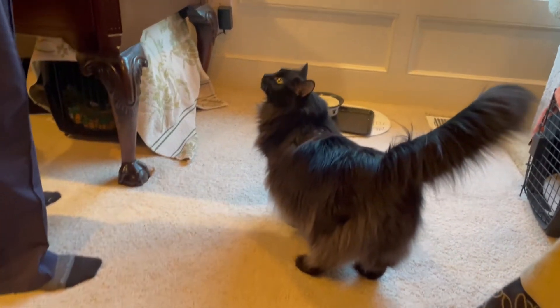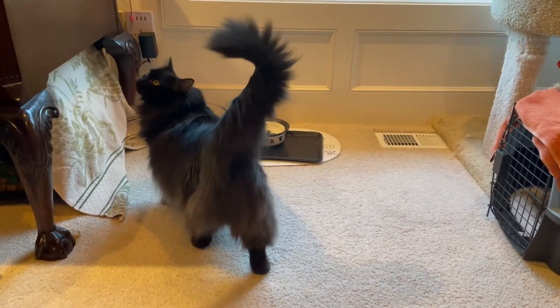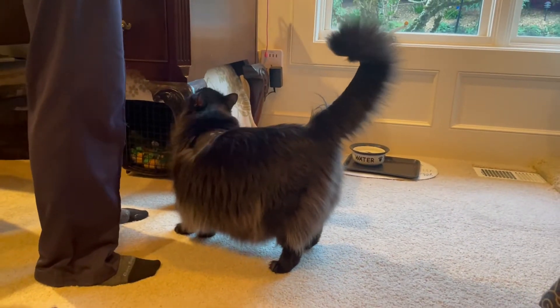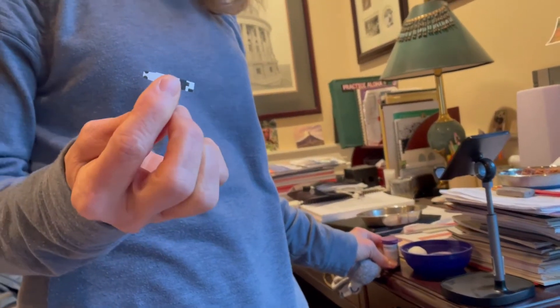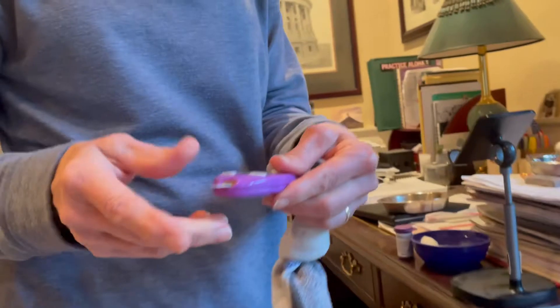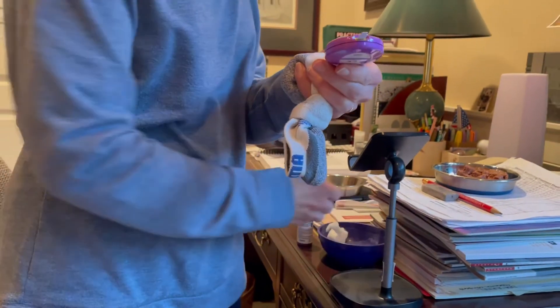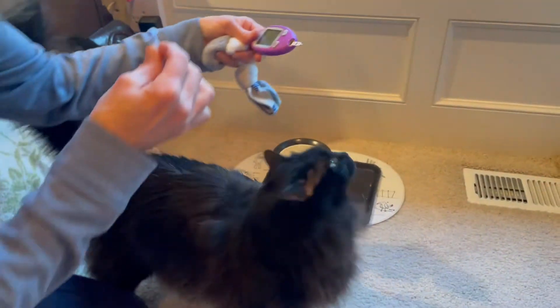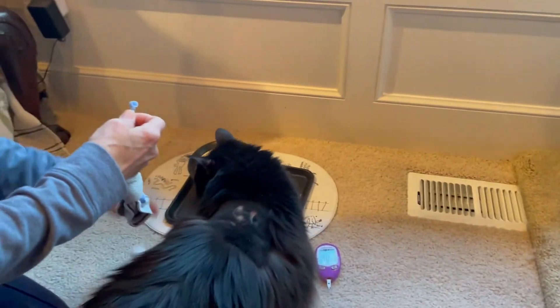This is Tabitha and she is ready for dinner, but before that I'm going to check her glucose. These are Alpha Trak strips — they look like this — and they go into this little monitor here. I'm not pushing it in all the way just yet. This is the little lancet that I'm going to use to poke her. I have everything together. She's very excited — she loves food.